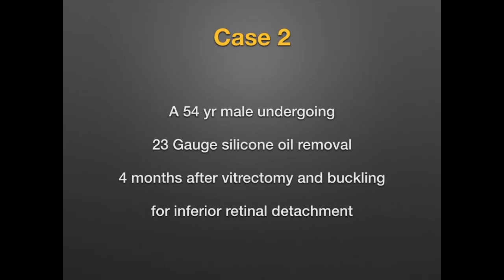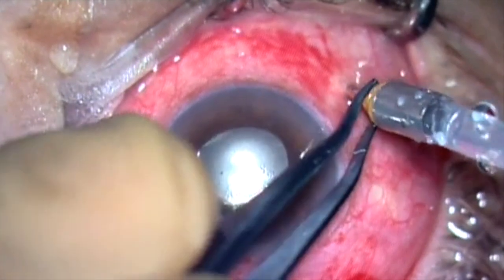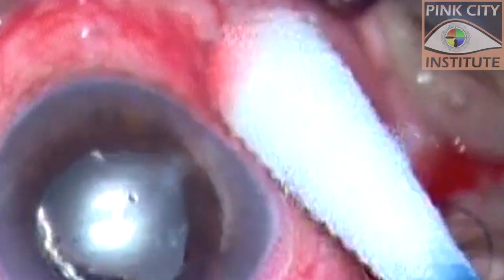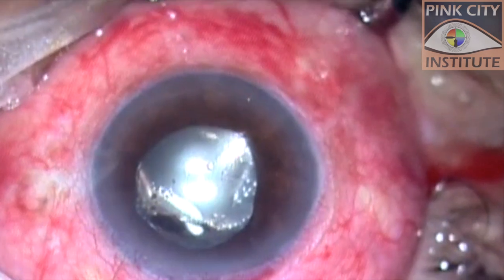The next case underwent a two-port 23-gauge silicone oil removal four months after vitrectomy combined with scleral buckling for retinal detachment in his only seeing eye. The infusion cannula was removed and the sclerotomy massaged. Balanced salt solution leak was seen from this sclerotomy.